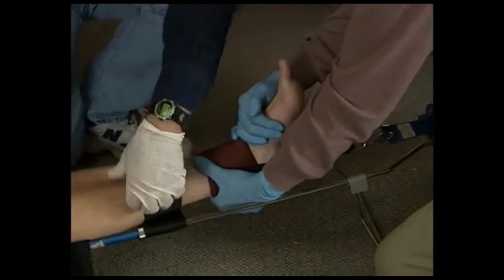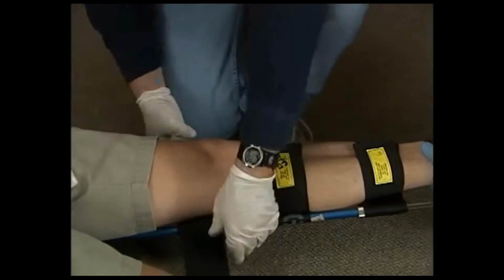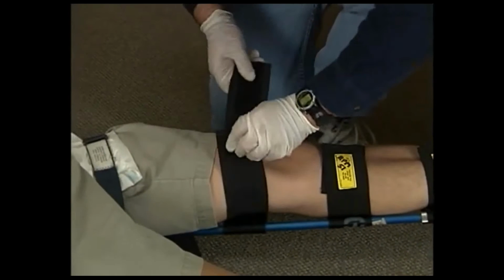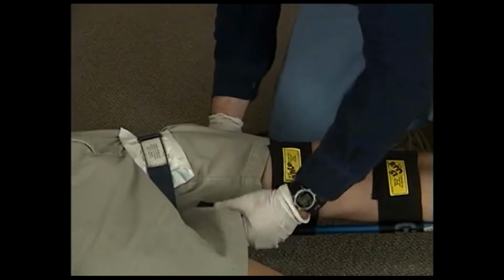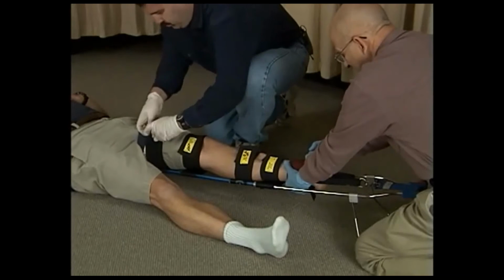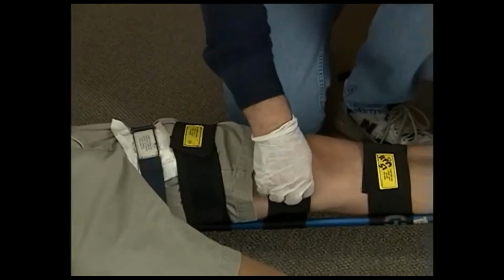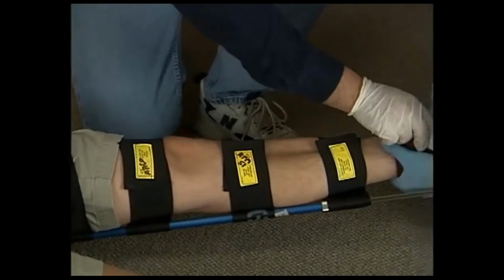Secure the remaining straps, and reevaluate the securing device. Reassess motor, sensory, and distal circulatory functions.